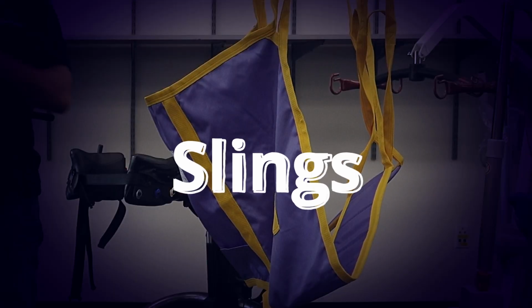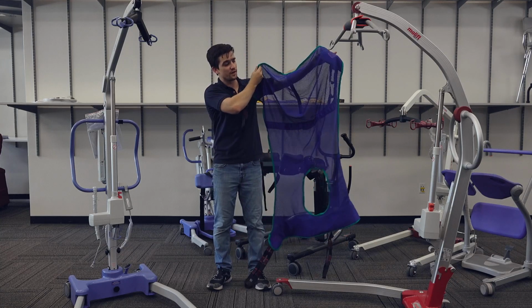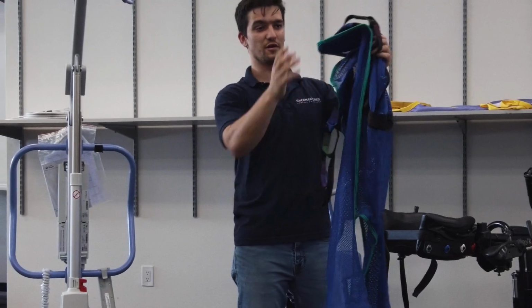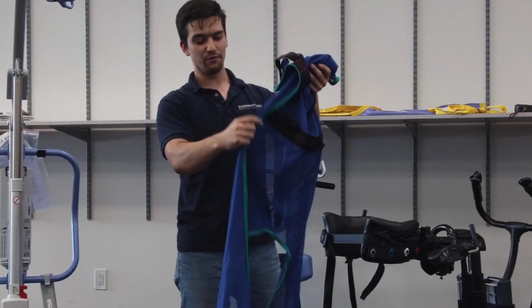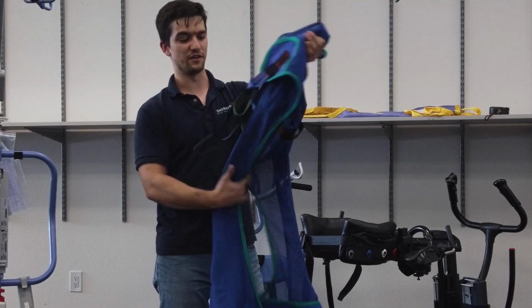The most common sling is going to be the full body. And this one comes with or without that hole there, which is the commode opening. With a sling like this, as soon as that user goes into, say, a wheelchair or a chair, you're not able, at that point, to remove this from under them. So it's going to be under them throughout the day as they're doing things.